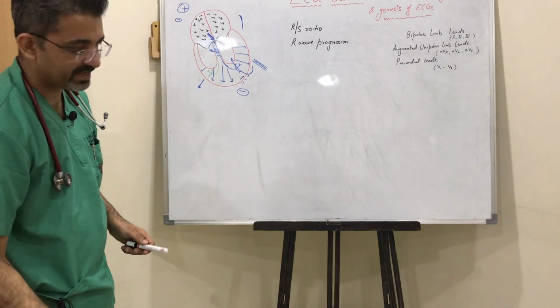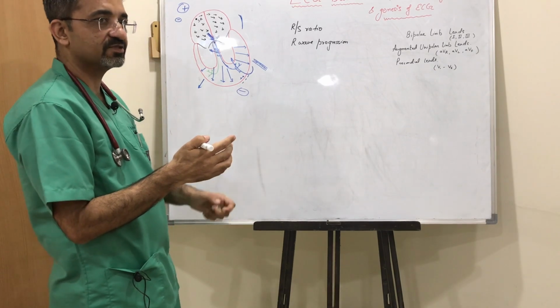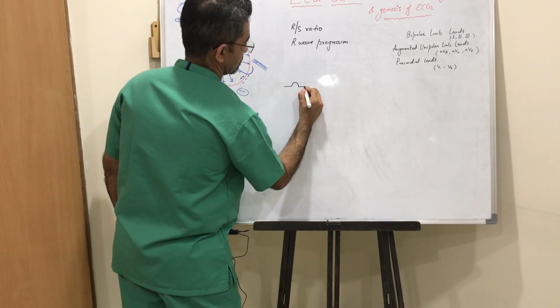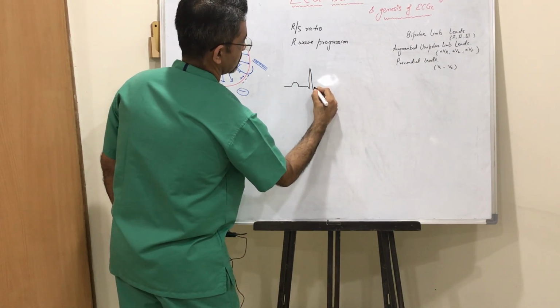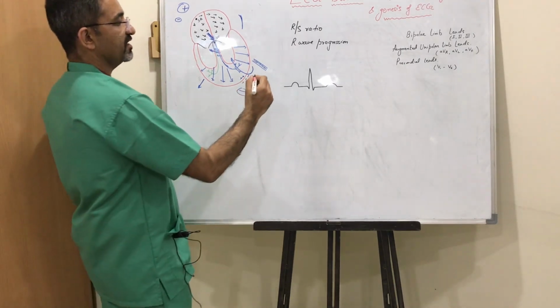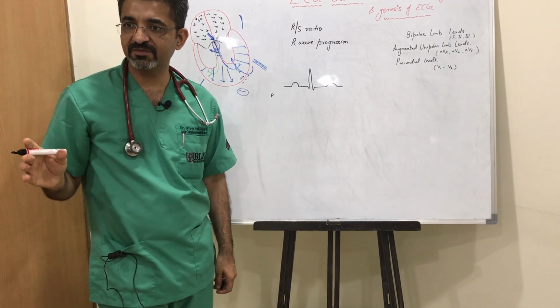Now, just before ending this lecture, I'll tell you in brief about normal PQRST values, and the significance of those will come in different lectures. If we talk about P wave, before getting into this we should know about ECG paper. Do you know about ECG paper?